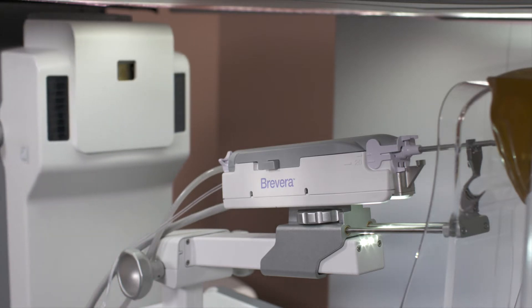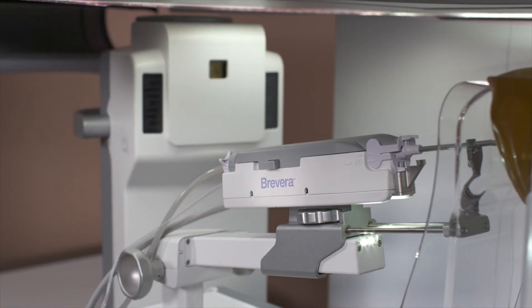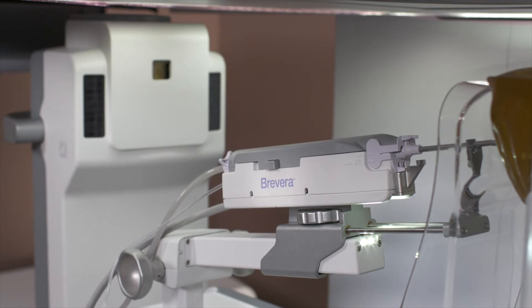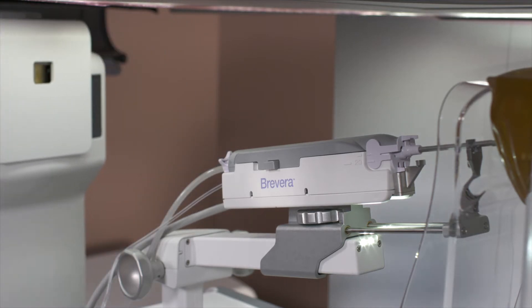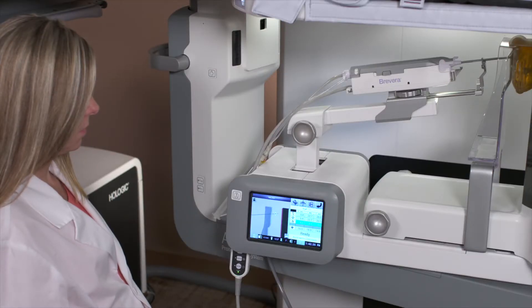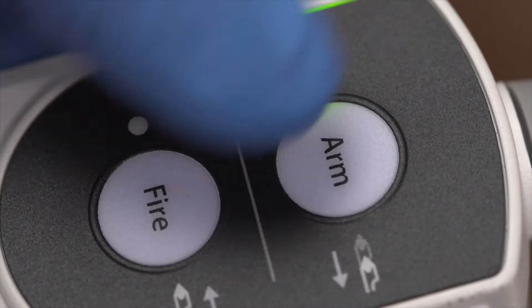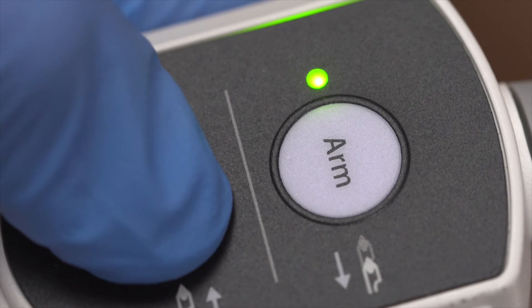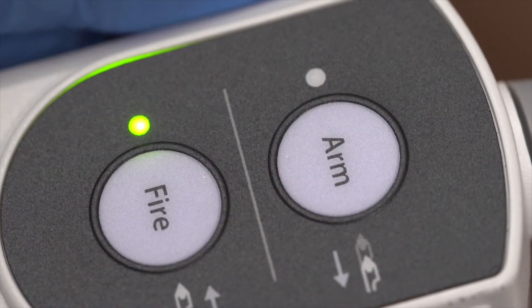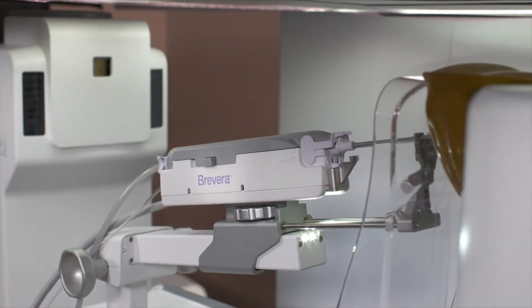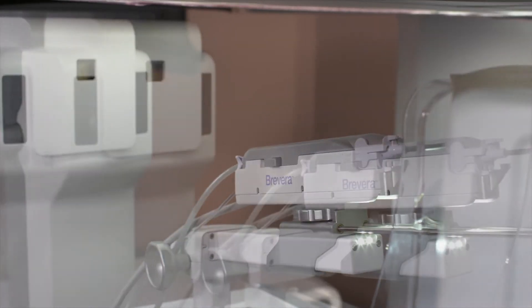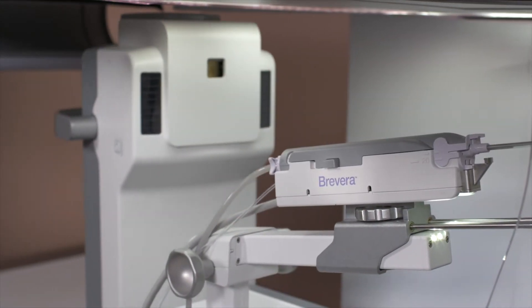Here, the physician can decide whether they would like to take a pre-fire tomo image or a pre-fire stereotactic image. Next, the physician will advance the needle to the final position by firing the Brevera breast biopsy needle using the remote and depressing and holding the fire button. A set of post-fire images will be taken. These images will show the needle in the final position.